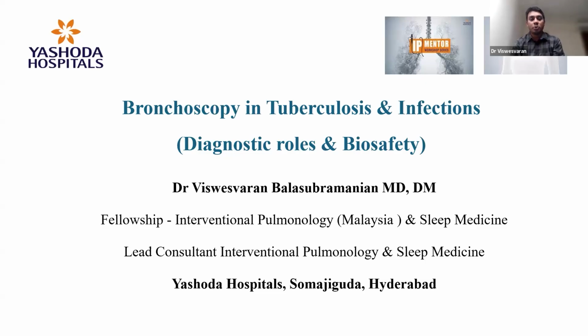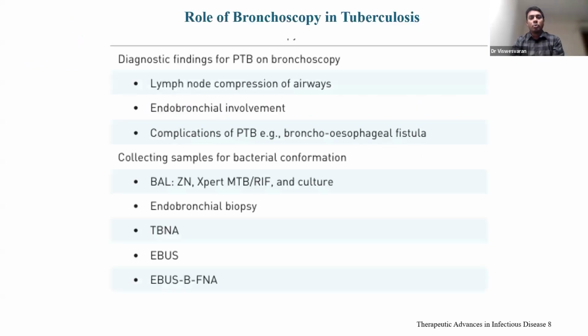Today I'll be speaking to you about bronchoscopy in tuberculosis and infections, primarily focusing on the diagnostic roles and the biosafety. Moving on to tuberculosis, bronchoscopy plays a very important role.